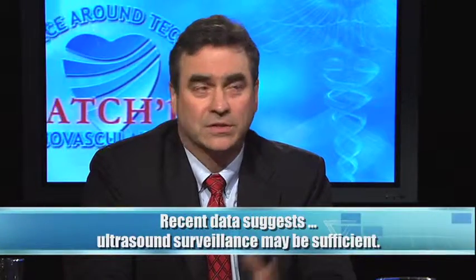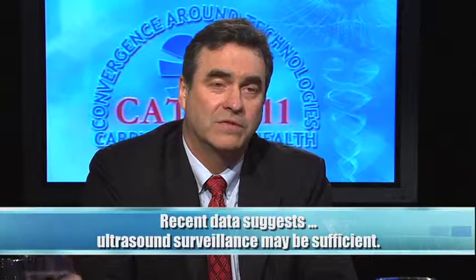And Steve, you were going to make another point. Yeah, I think it's similar in any aspect of cardiovascular disease. It's cardiac, it's vascular, it's all the blood vessel diseases, that when we do an intervention, be it a stent in the heart artery, be it a stent in the aorta or in the carotid, there's a lot of other blood vessel there that's not treated by that stent.